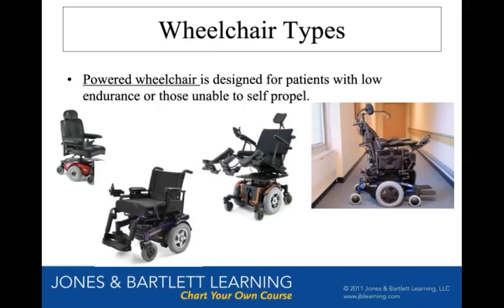There's other ways that you can drive. The most common way is with a joystick with your hands. And you can see those on most of the chairs in the pictures. Now, even if you don't have full use of your hands, even if you have just a few fingers with a little bit of finger movement, or a little bit of hand movement left, you can have a positioning device placed so that your arm will always be positioned appropriately and maybe tied in place, so that your hand will always be on the joystick, so that your arm doesn't fall off and then you're just stuck.